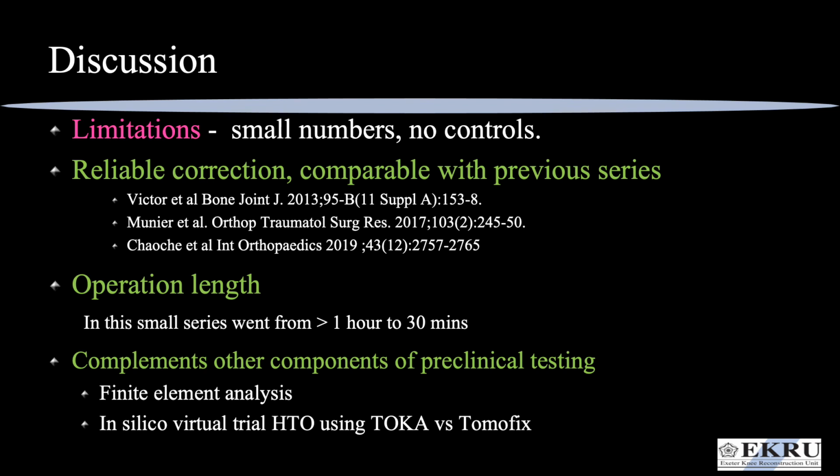The number of cadaveric operations performed in this study is obviously small, and there were no control cases to permit comparison. However, the aim of this study was to explore the reliability of the Toka system in the preclinical setting, and which has shown that we can get accurate correction comparable or even better than some of the other series whose references are listed here.